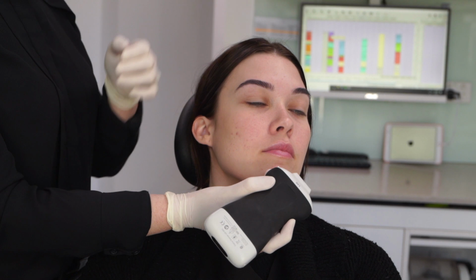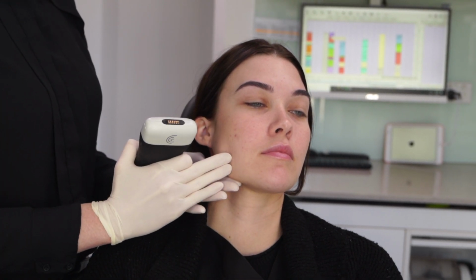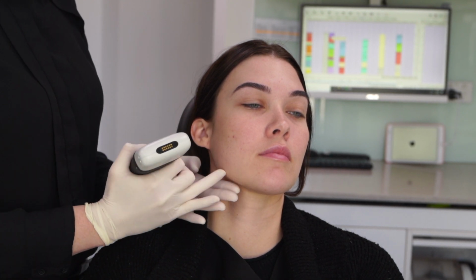Assessing the face, we start with the jawline position. The reference here is the masseter muscle. In this position, we will be looking for the facial vein and artery, and we can also visualize the parotid gland.